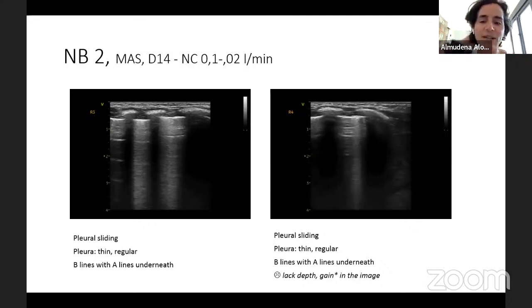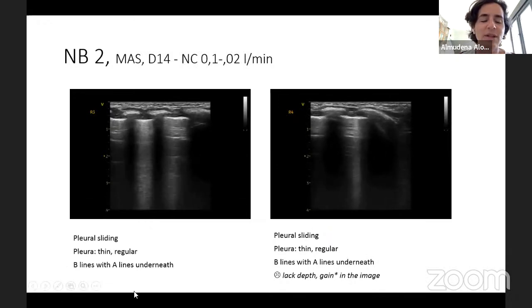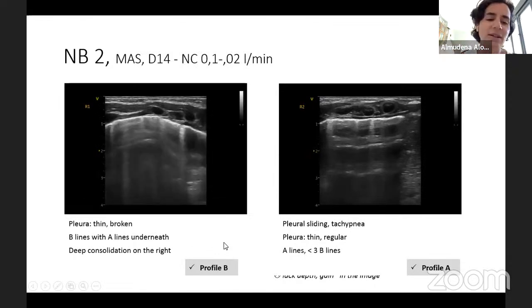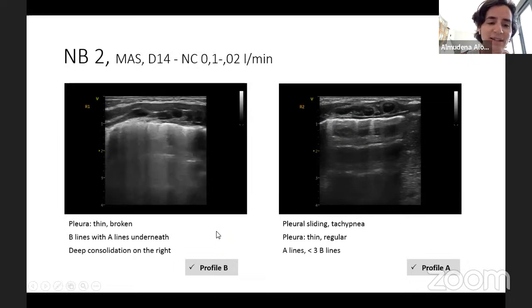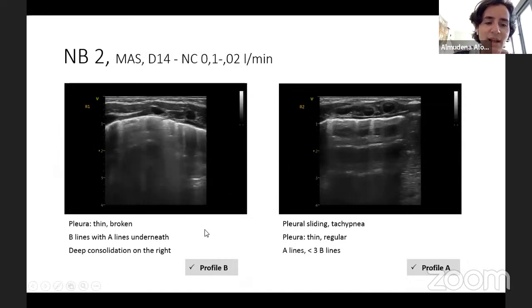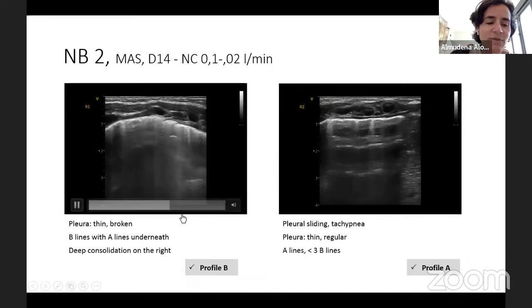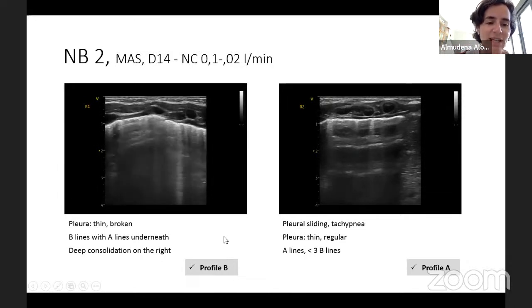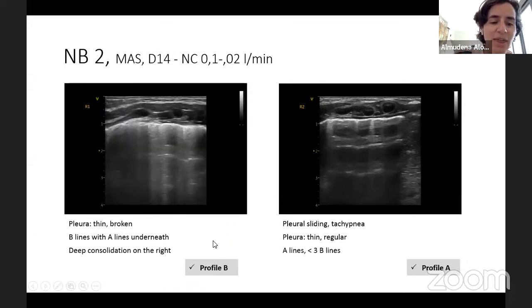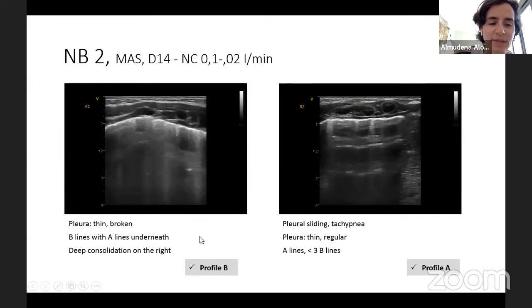These are really quite nice images, the ones that you're showing us, Margarita. And the first one that you've already passed, you mentioned that you have doubts about a consolidation there. Maybe there's a consolidation, but you cannot really see it, because unless you have a consolidation itself at the level of the pleural line, everything that you can see underneath is just artifacts. Whatever you see, it cannot be a consolidation, never. Unless you have fluid or consolidation, atelectasis, whatever you have underneath the pleural line are just artifacts. You don't really have that image itself in the lung. I don't know if you understand.